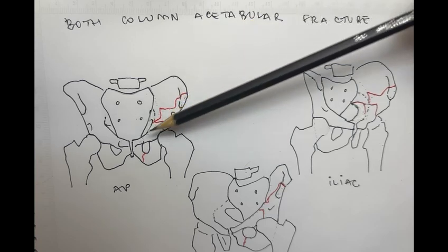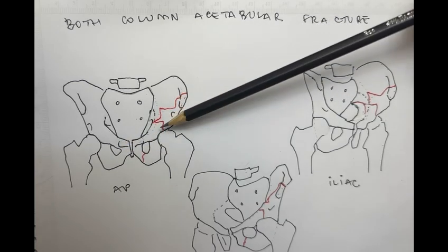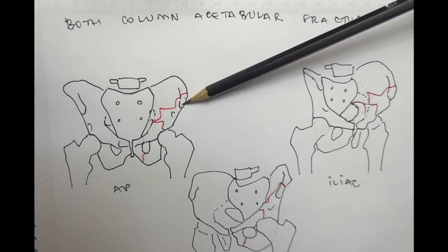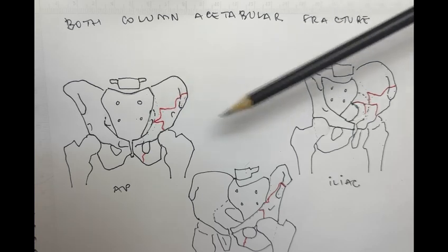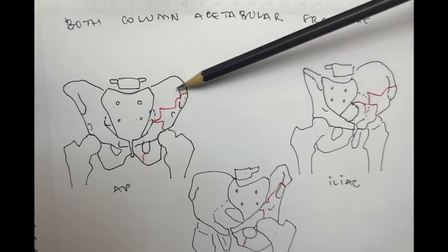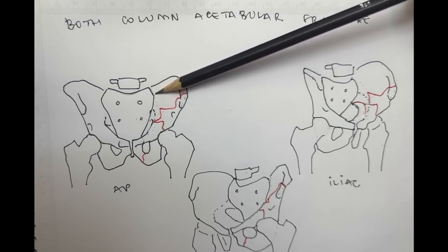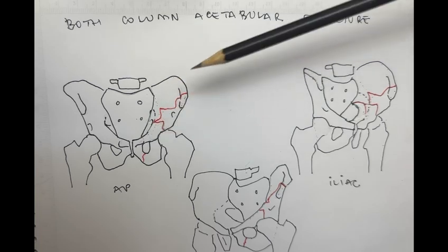So we'll perform an ilio-inguinal approach and develop all the three windows, the first, the second, and the third window. And first of all, we will fix the iliac bone, this fracture and this fracture, and then we will reduce and fix the additional anterior column fracture, and then fix with a plate that comes from the iliac bone, just lateral from the sacroiliac joint, and go into the ramus.